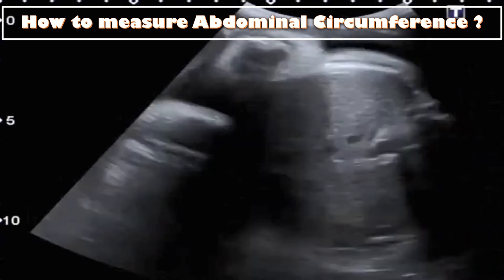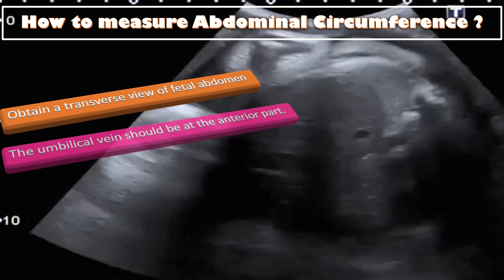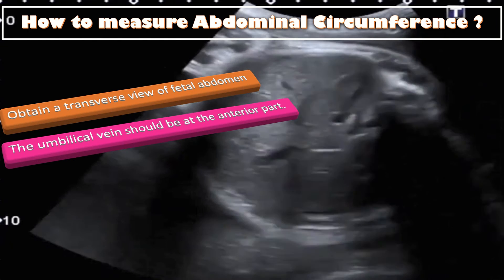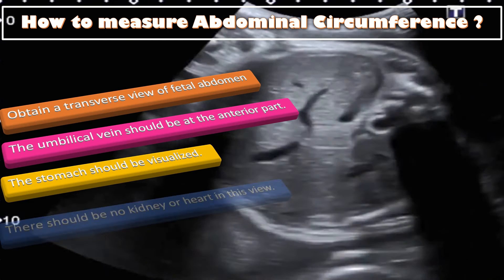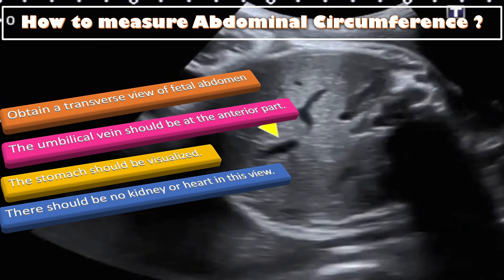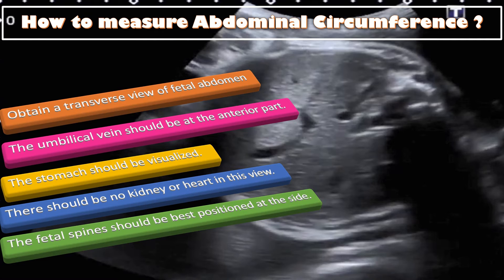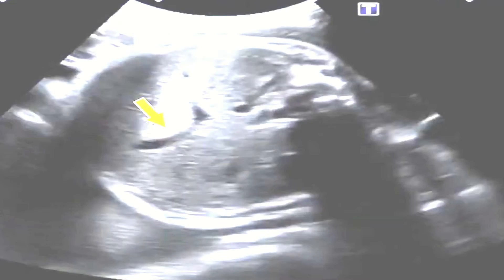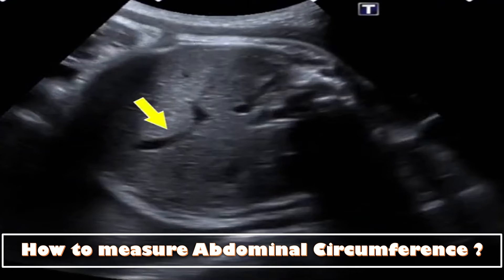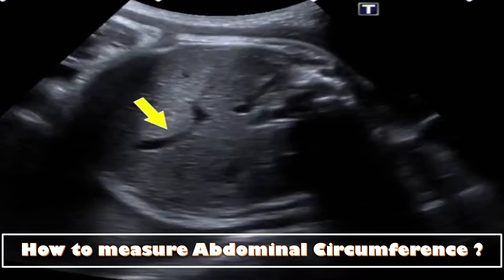To measure the fetal abdominal circumference, first obtain the transverse view of the fetal abdomen. The umbilical vein should be at the anterior part, the stomach should be visualized, and there should be no kidney or heart in this view. The fetal spine should be best positioned at the side. Place the caliper on the outer border of the abdominal skin to measure the abdominal circumference.